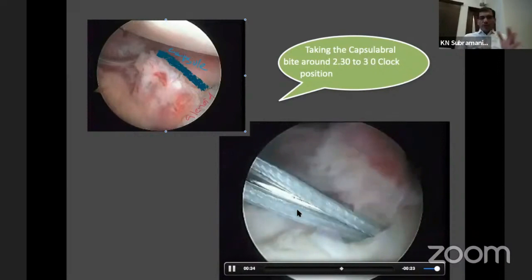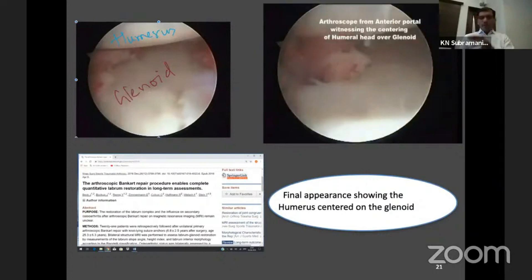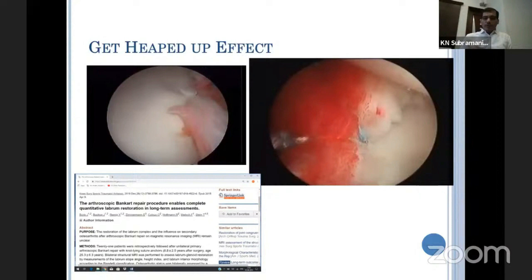You are gradually tensioning from inferior to superior and tightening the anterior capsule — all three steps together. Make sure the head of the humerus is centered on the glenoid at the end. Once the anterior capsule is tightened well, the humeral head will sit nicely in the center of the glenoid, confirming that tensioning has been done appropriately. This is what I call a total arthroscopic Bankart surgery: inferior capsular shift, anterior labral repair, and anterior capsular tightening all together. Studies have shown this restores glenoid topology close to normal.